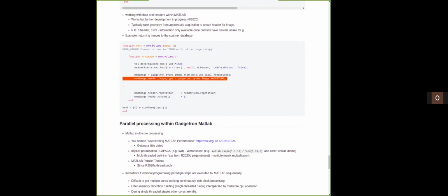And just as before, we have the step function, and then what gets passed down to the next step is a pointer or lambda function to the internal function, with also the reference to where to get the data from. So that's a very common idiom within the examples, and which we've just followed.